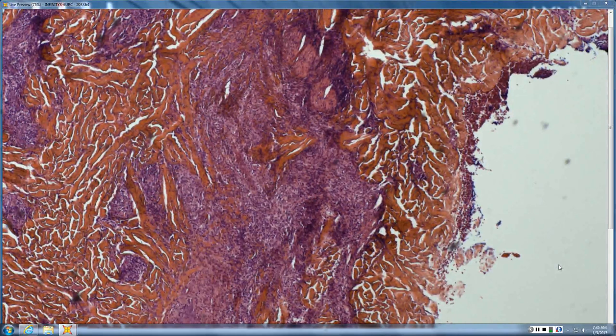It often goes deep. It can be the presenting sign of zoster. It can be herpes in immunosuppression. It can be systemic disseminated herpes. One of the typical clues is it tends to be pretty inflammatory. It's often deep. And you get associated necrosis of sebaceous gland. And that's one of the helpful clues.